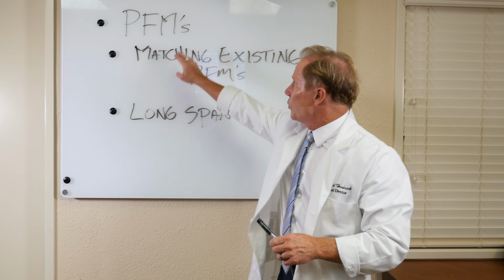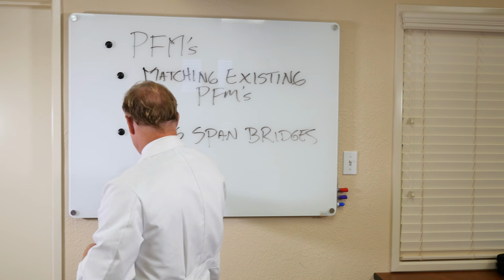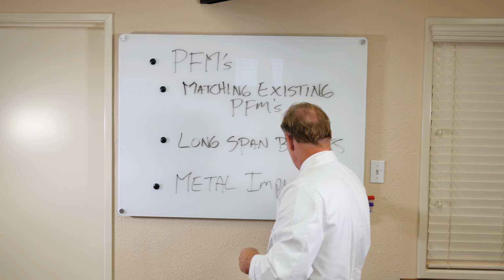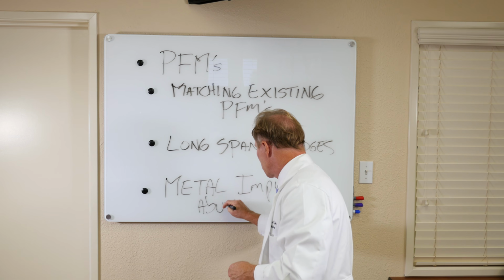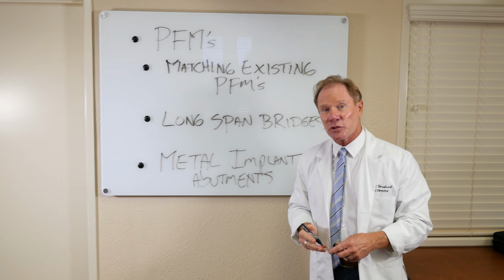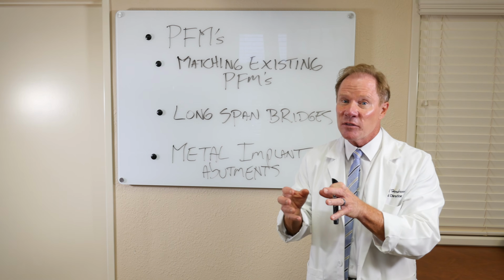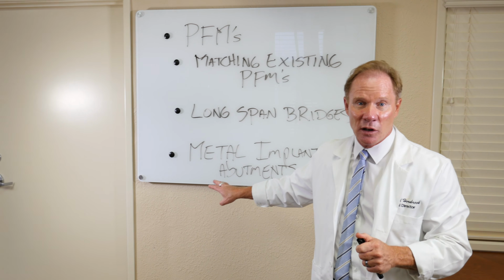Sometimes we will recommend PFMs on top of metal implant abutments, only because we need to block out that metal, although we can certainly utilize other materials to do that. But oftentimes, because of where the implant was placed, the abutment, even a custom abutment, is not as ideal as possible, and so we like to use metal on that.